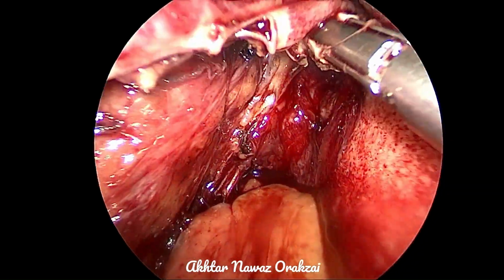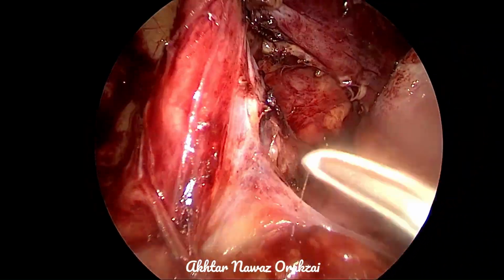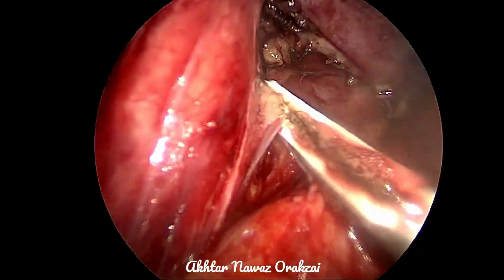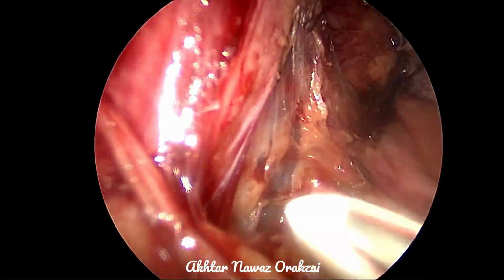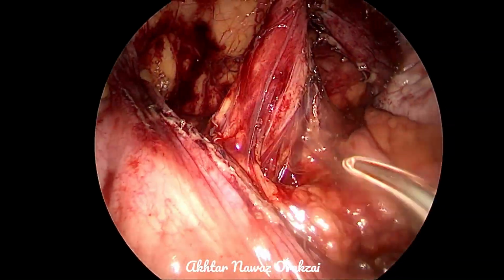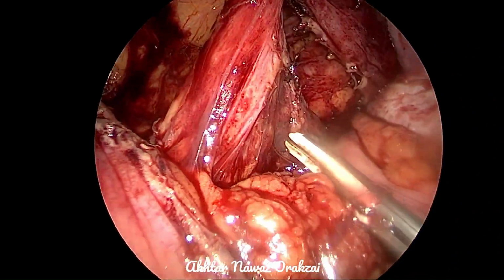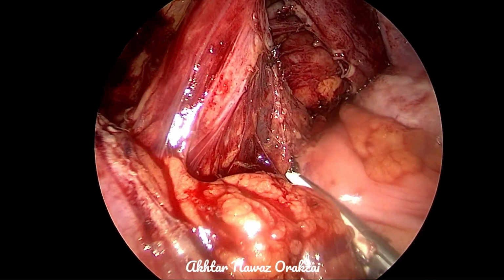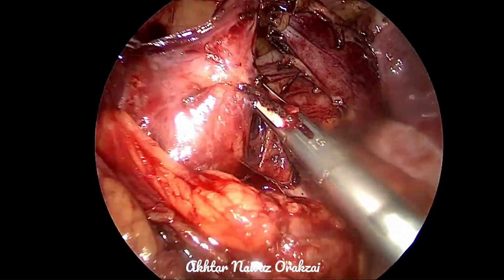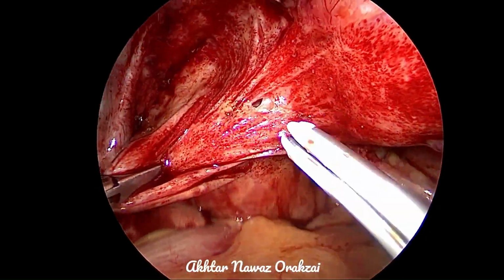So mobilization of the ureter up to the point where there is fibrosis is important. Number two, mobilization where we can see that the ureter can be anastomosed to the bladder without any tension is also an important thing to keep in mind. Complete mobilization up to the level of ligation or injury is not necessary.